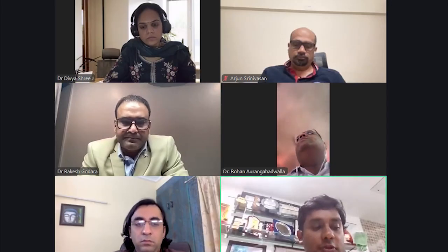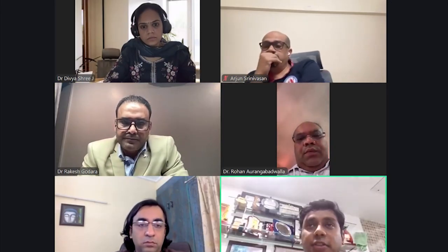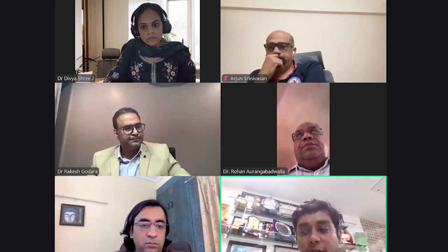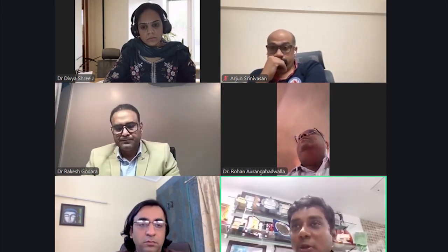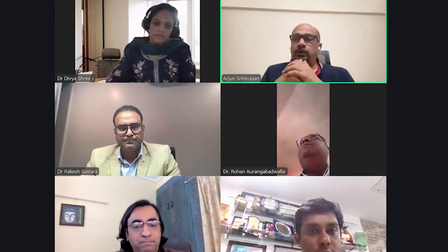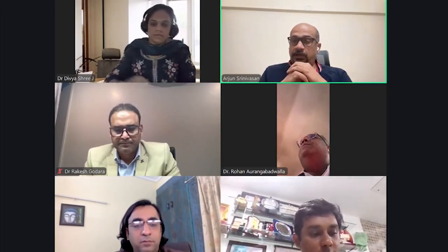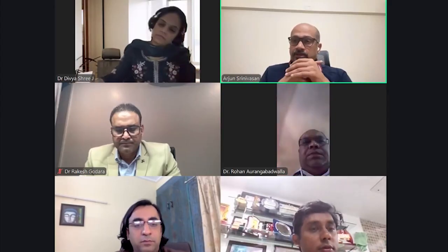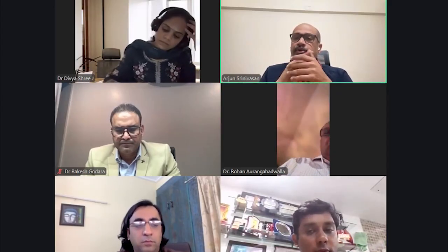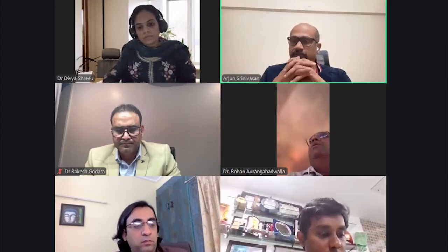And again to Dr. Arjun sir. So what is the recommended post-procedure observation time? So let's say you do a procedure. When do you actually go to the patient and say that your patient is safe? I think over the years we still can get a little enthusiastic and try and declare it before all things are fine. So I think the earliest that you would do, when a patient is under GA, is when your anesthetist says that all is good and the patient has come out.